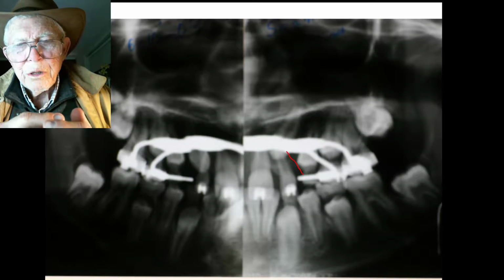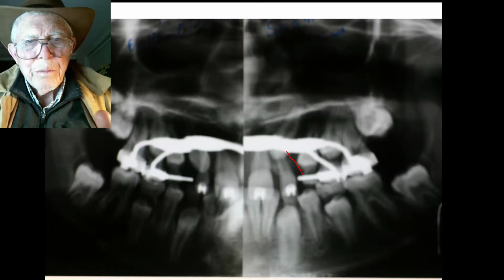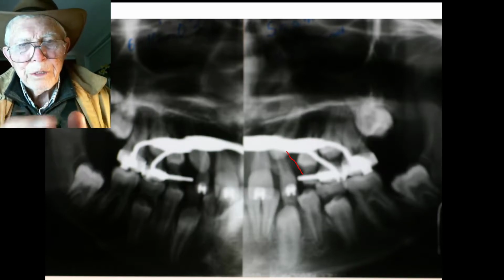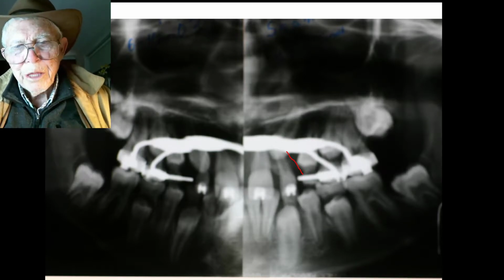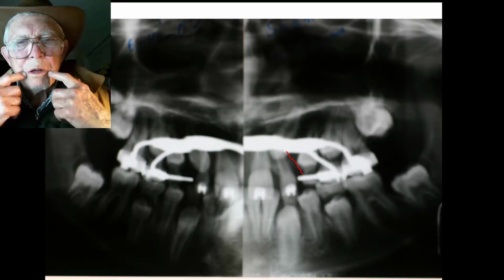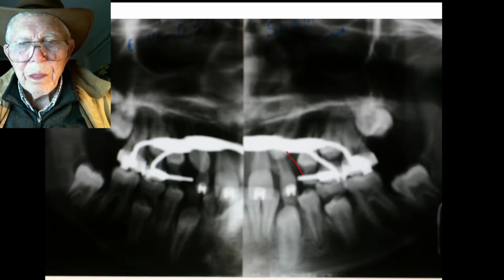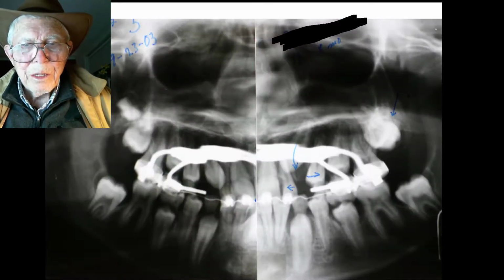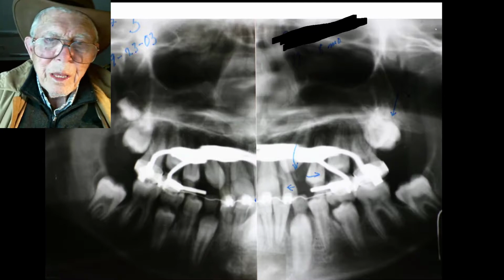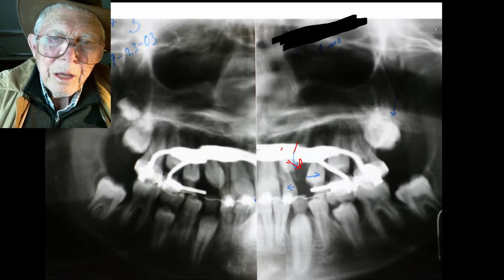So there's a lot of understanding that you need to know about the separation of the sutures up here in the palate, bringing the centrals and the laterals together in that space, and having the space that you created in the spot you wanted it to be. And so you go through that. Now as we get that wider, and you see the space is better, and now this follicle is pushing that crown in that direction. So it's headed down here.